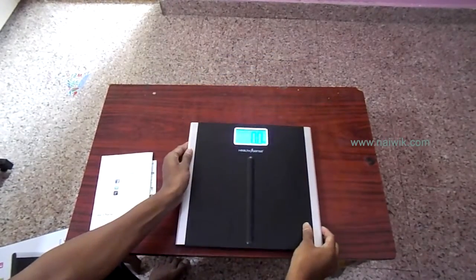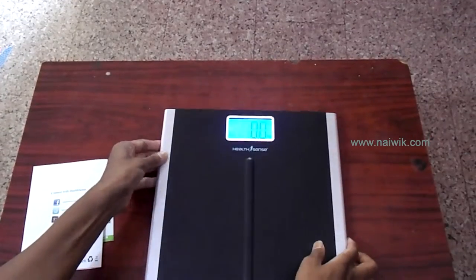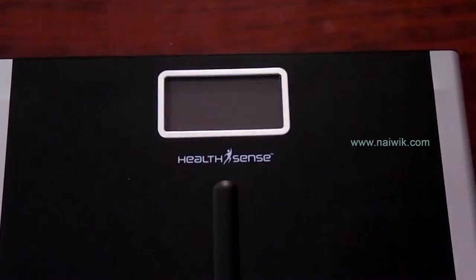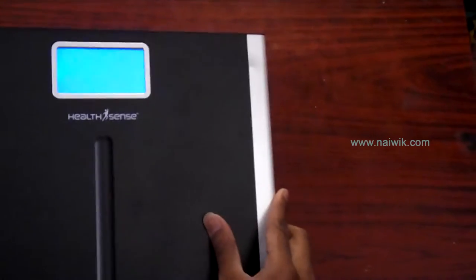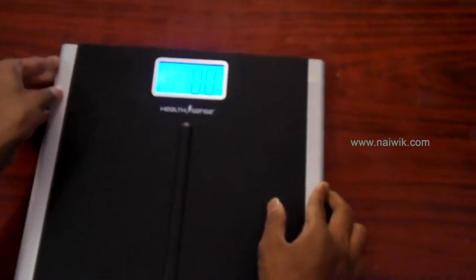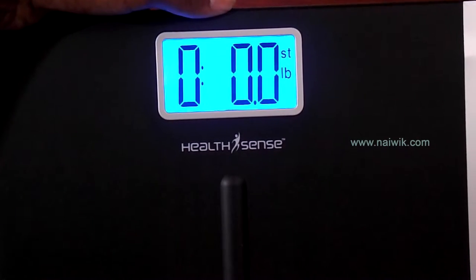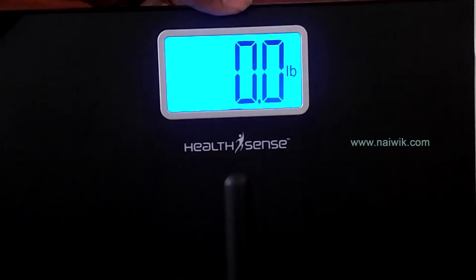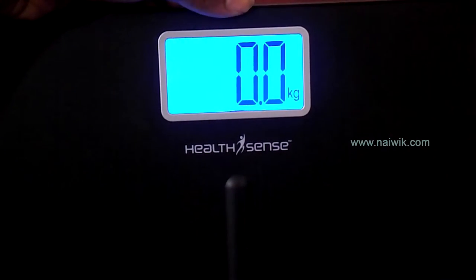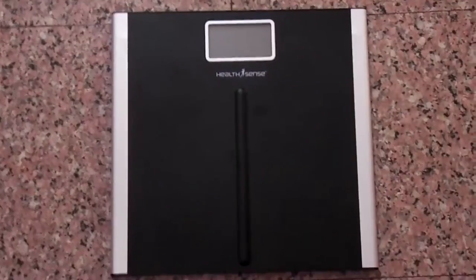Here is a button to switch on for the first time, and the same button can also be used to display the weight in kilograms, pounds, or stone. By default it shows in kg. Now we will try to change it — it is showing in stone and pound, and the default is kg.